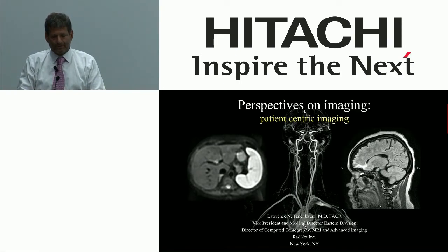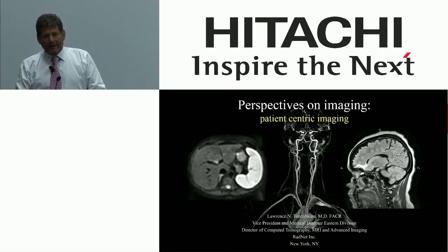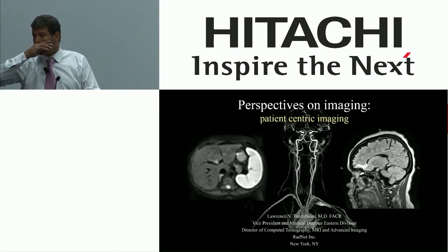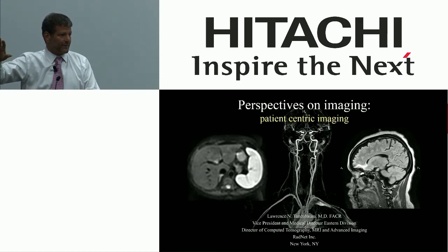How much do you use smoothing algorithms on a lot of those protocols you were showing? Do I use smoothing algorithms? Anybody do CT in here? Everybody familiar with iterative reconstruction? What happens with iterative reconstruction? You use iterative reconstruction, a clever reconstruction method that removes noise from the image, and it allows you to reduce your radiation dose by 50, 60%. Gold standard quality, 50, 60%. Okay? You see where I'm going here.